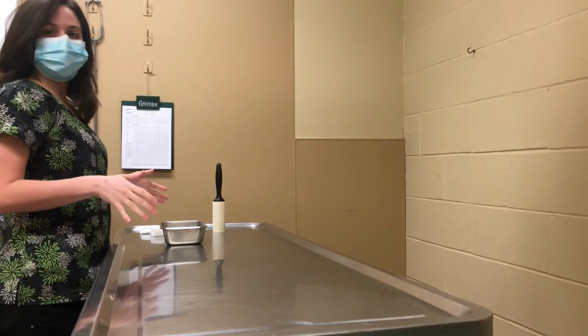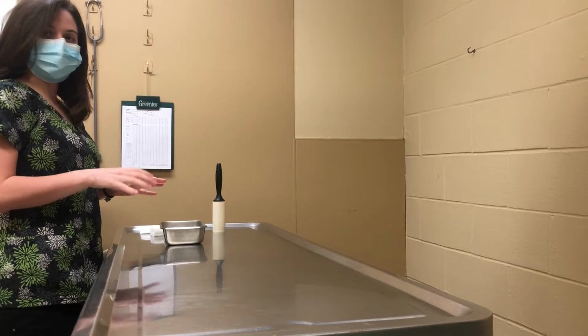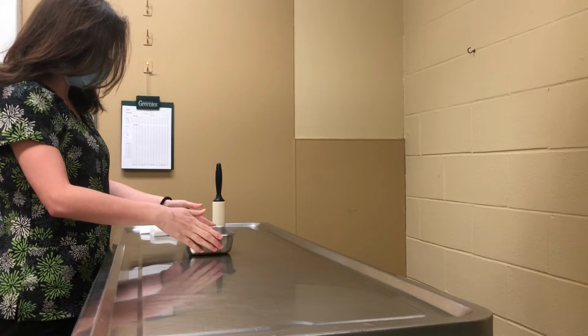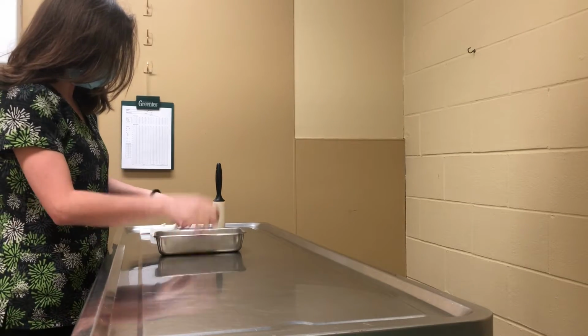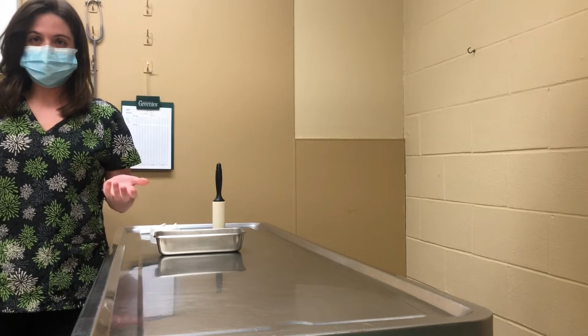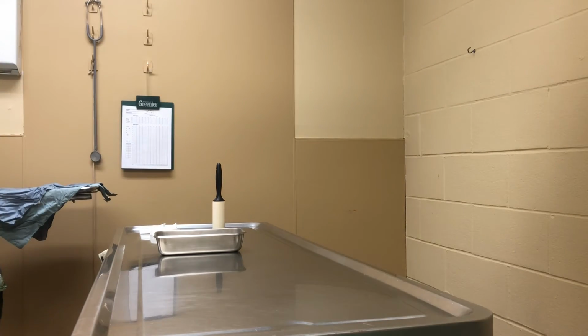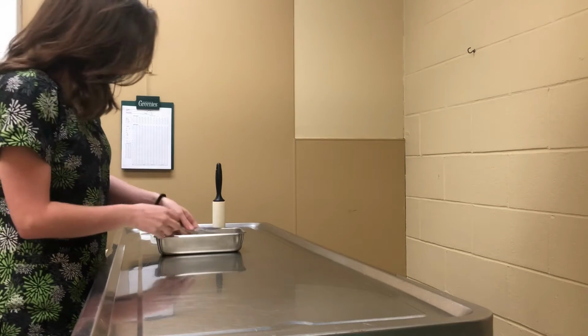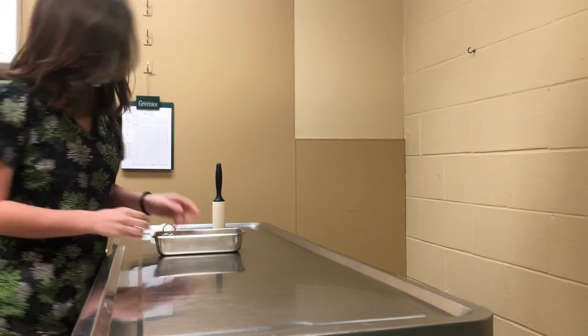So now I'm going to demonstrate how to put together, in this case, a spay pack. So I have my container that our instruments are going to sit in, and the spay pack has 18 instruments. So in the order they're going to go in, we have our Mayo scissors, we have our Metzenbaums, we have our needle holders. So in that order I'm going to set them up like so.